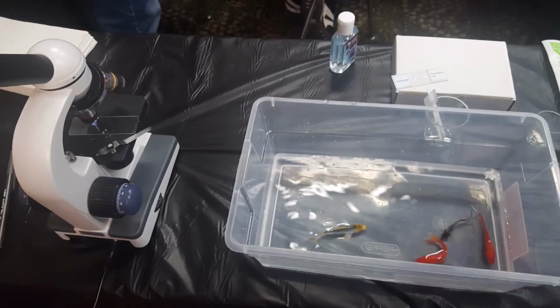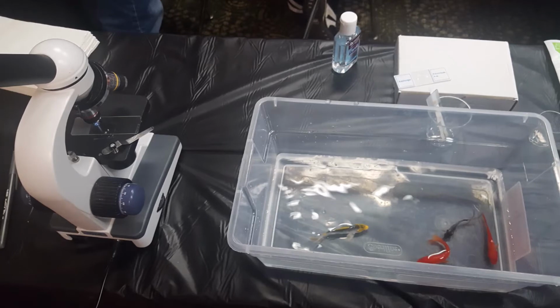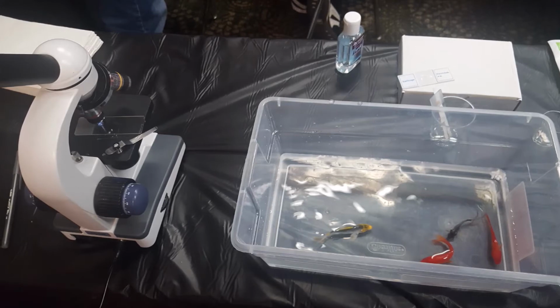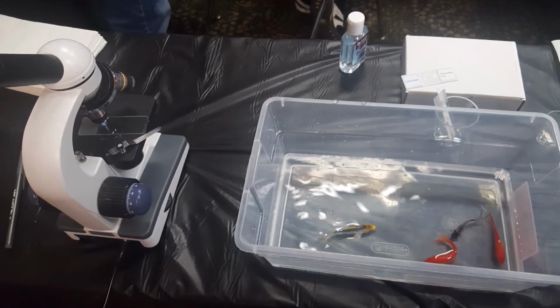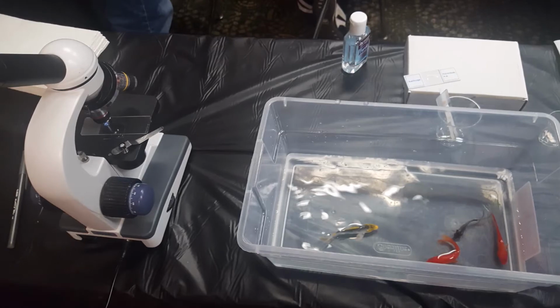So in this photo you can see the equipment we were working with, just a simple monocular microscope, nothing too fancy. I think the one we were using was priced at about $100. Doc said there's no point wasting money, just a simple microscope will do. The fish we got to test were a couple koi and the feeder goldfish. I can tell you right now the feeder goldfish were infested.